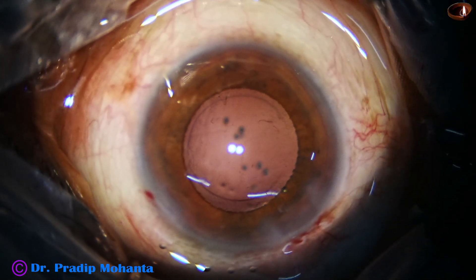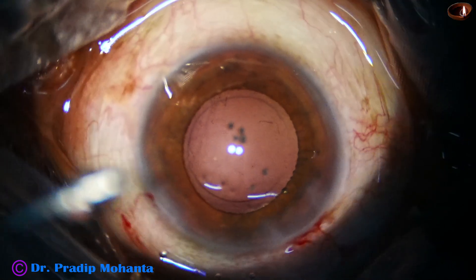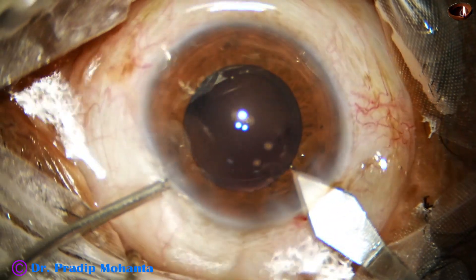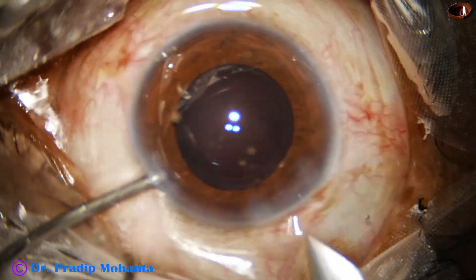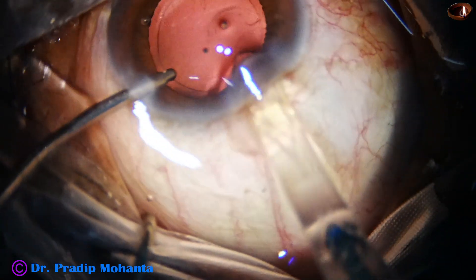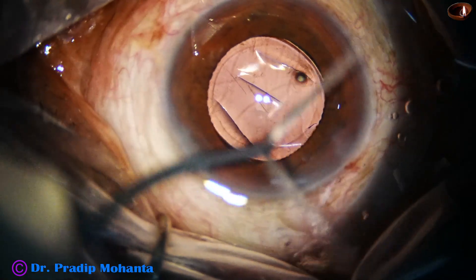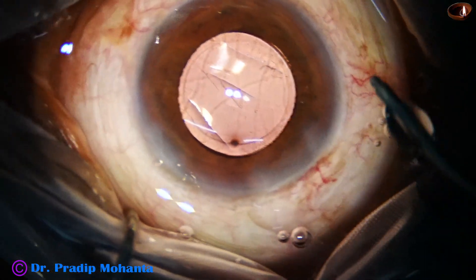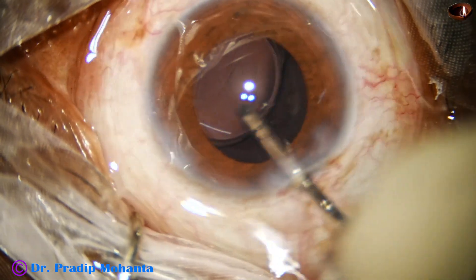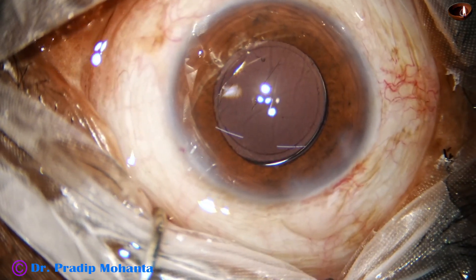Cortical clean-up is done and now is the time for implantation of the intraocular lens. I am using a V cartridge, so I am going to enlarge the main wound. The main wound which was 2.8 millimeters is now about 3 millimeters. Here goes the intraocular lens. Just by a push of the left hand instrument — here the irrigating cannula — you can place the trailing haptic in the bag. The posterior capsule is polished again, going under the intraocular lens.